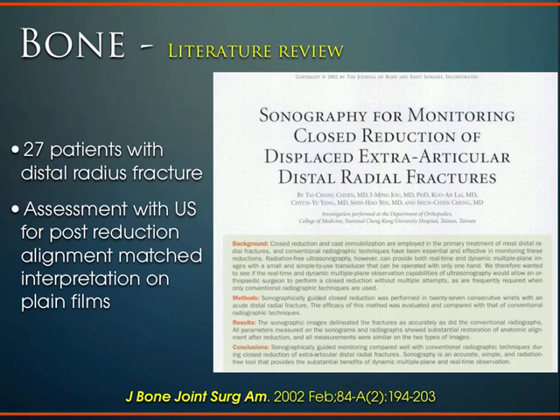And that's true for bone as well. And then as you try to put it into a clinical perspective, okay, great, I can image it and I can see the fracture, but can I use that to then treat the patient? When we talk about, especially in an emergency room setting, we're doing reduction of fractures and closed reduction of fractures, and there's one particular study showing that it can be quite successful with that.